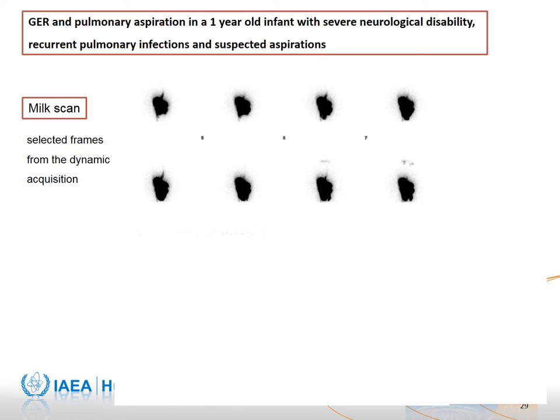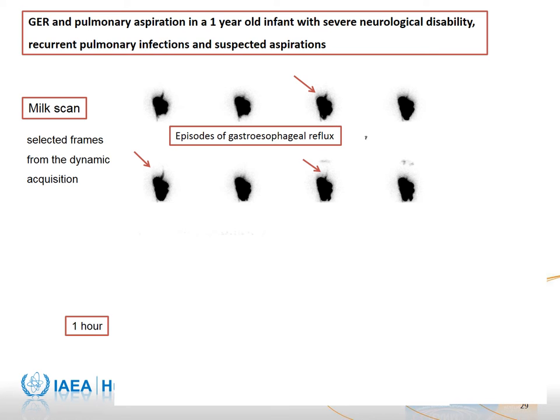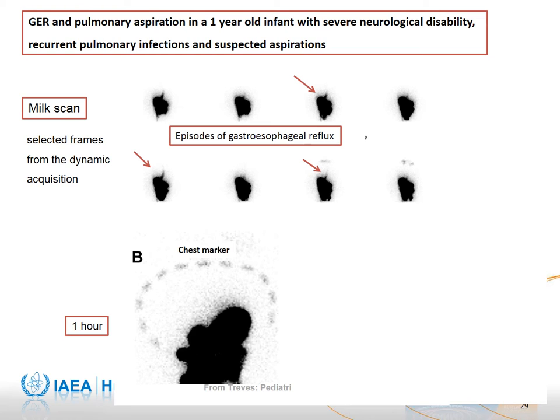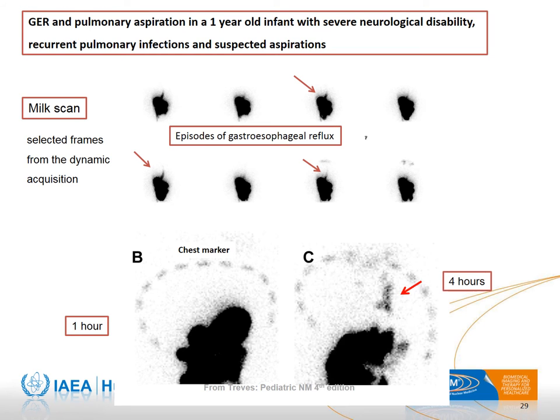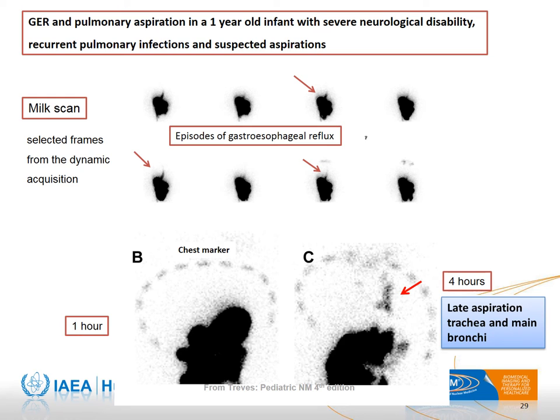This milk scan was performed on a one-year-old child with severe neurological impairment and recurrent lung infections in whom aspiration was suspected. The arrows show episodes of reflux on selected frames. The one-hour static image of the chest shows clear lung fields; however, the late four-hour image shows tracer activity in the trachea and the proximal left and right main bronchi, indicating pulmonary aspiration. This example emphasizes the importance of obtaining a late image, as it increases the sensitivity of the study in capturing an episode of pulmonary aspiration.